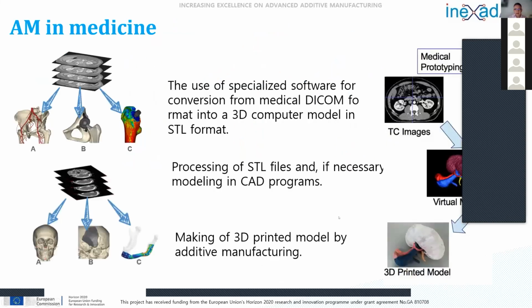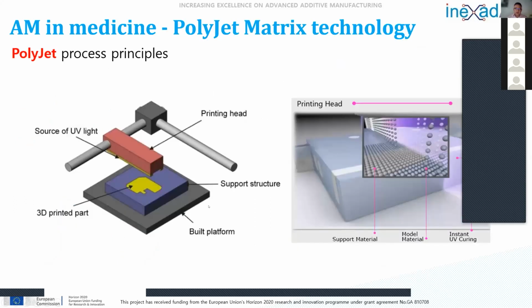After that, the second step is segmentation. So in case of using CT scanners and MRI, you must remove everything which is, I should say, noise from the result of this type of scanning, in order to get only the part of the body or the part of the patient that you really need. So this is the second step of our approach.